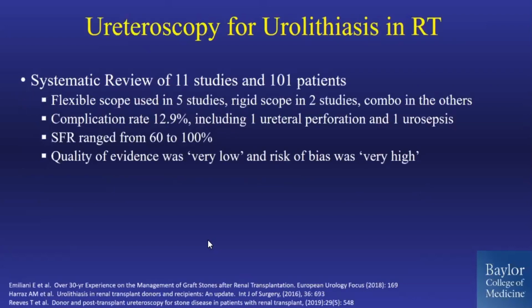Speaking of ureteroscopy, this nice systematic review is the most robust series, collection of data that I could find. And I'll sum this slide up just by saying that the complication rate at 13% was very reasonable, and the stone-free rate was favorable compared to shockwave lithotripsy, with some caveats about the quality of the studies looked at in the series. But I think the point is, as a proof of concept, ureteroscopy is a very reasonable option in the transplant patient, but it's not easy.